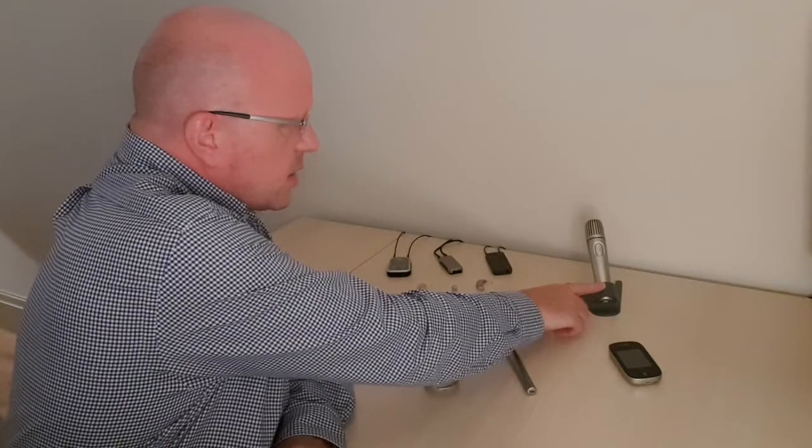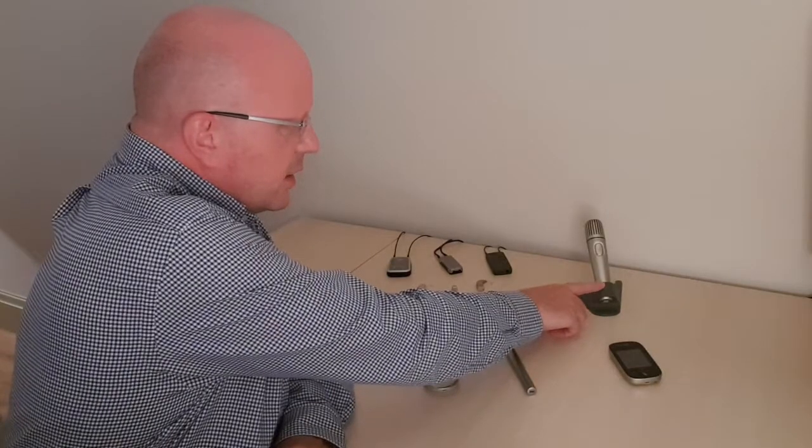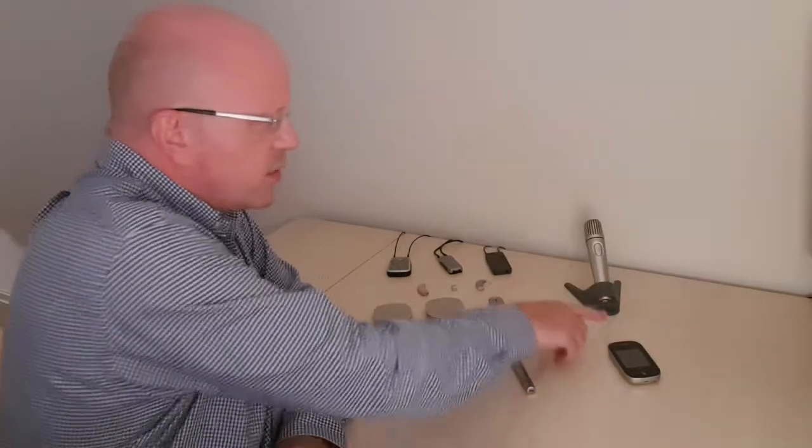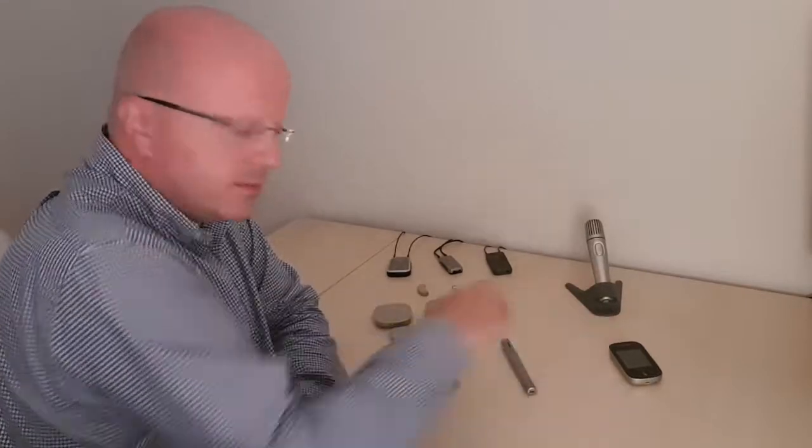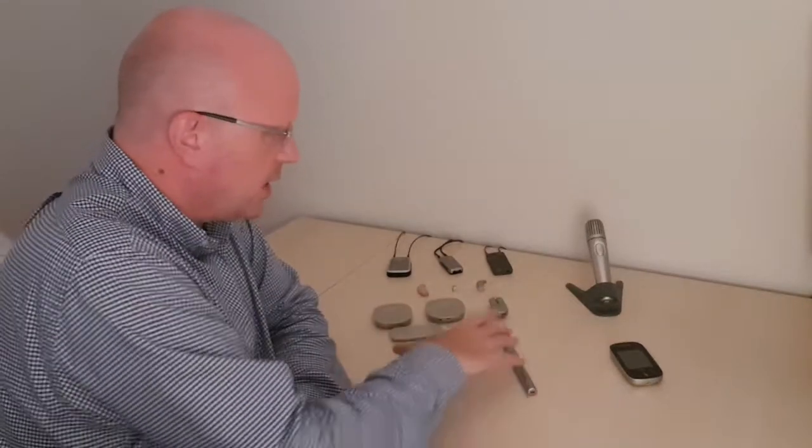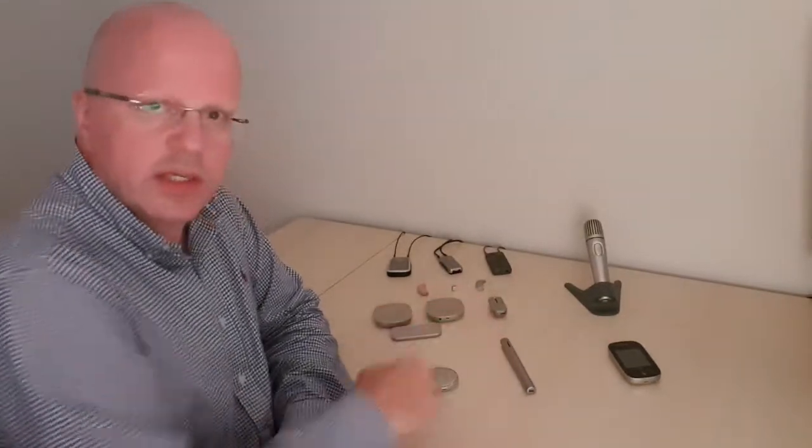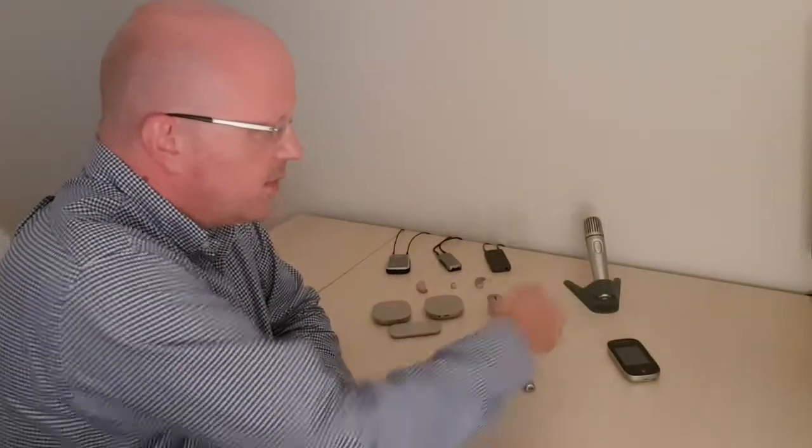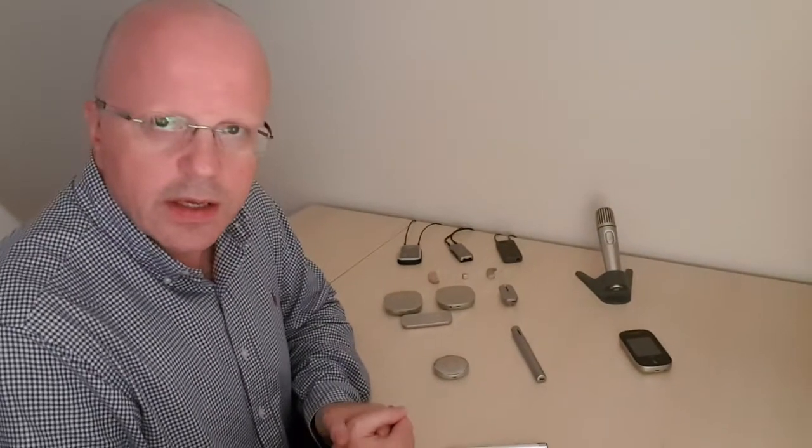The pass-around mic you see at the back there, that works with the touchscreen mic. So these two work together. And these transmitters here all work together, but they don't intermix. Okay.